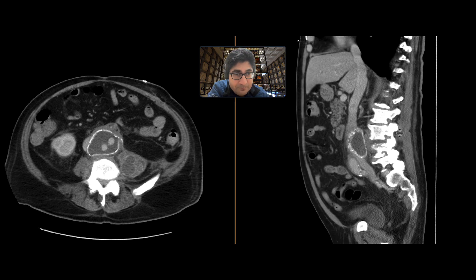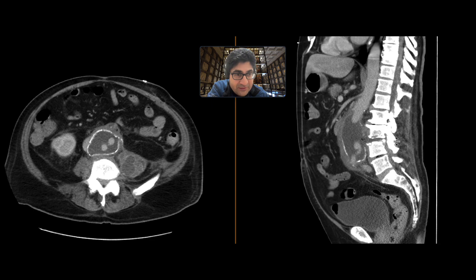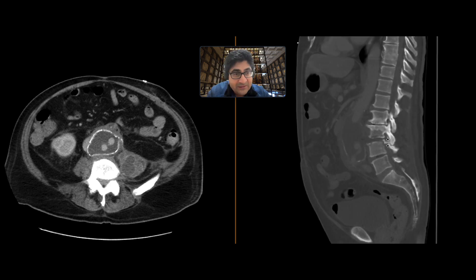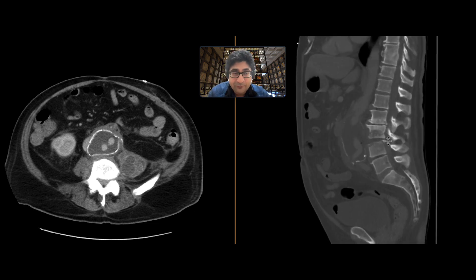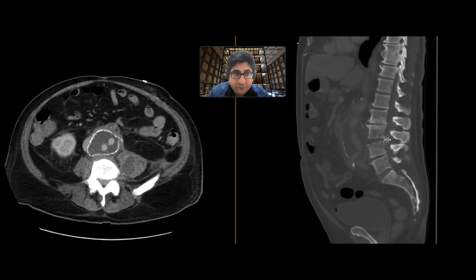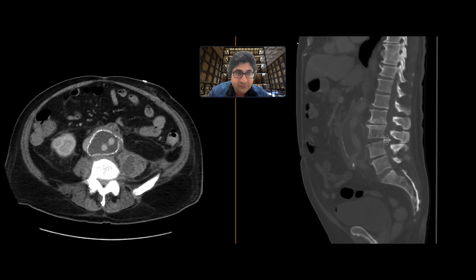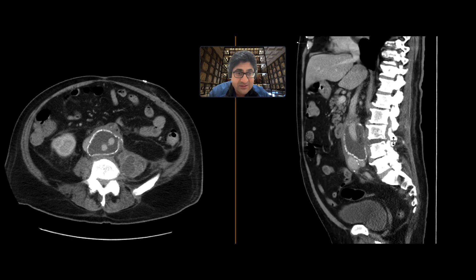We can then look on the sagittal view — I think this shows it really nicely. Right in that area, we can see a portion of that graft site has been eroded, and there's gas going into it. We can see that the end plates of L3 and L4 are very irregular. There are erosions, areas of lucencies, and gas in that disc space.